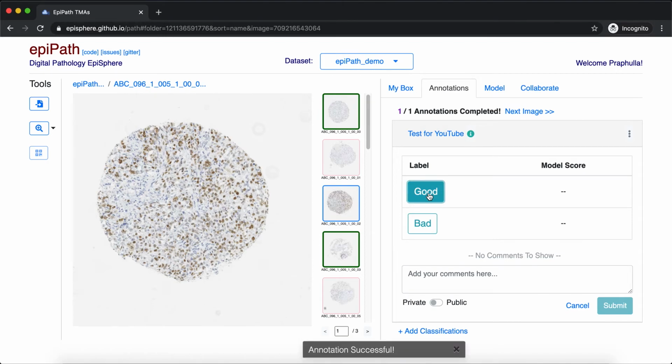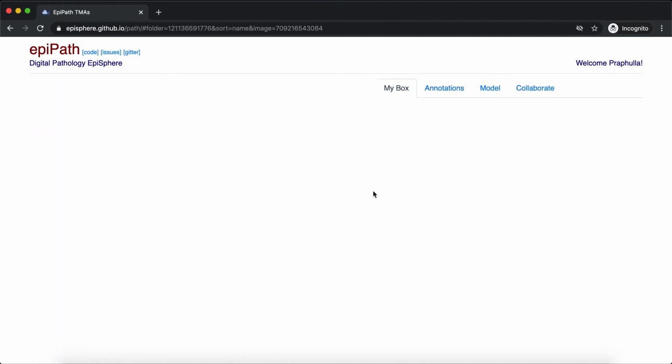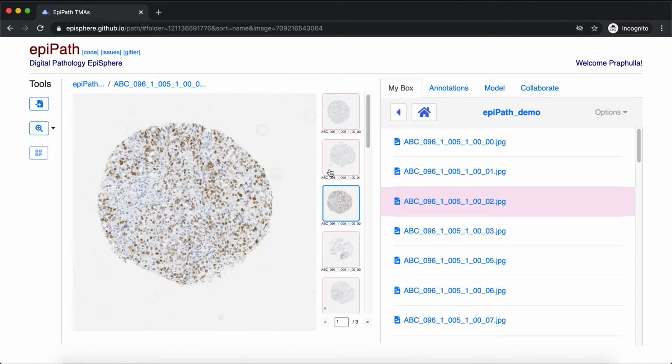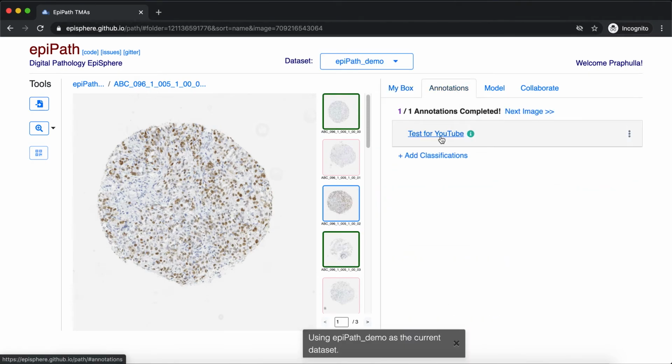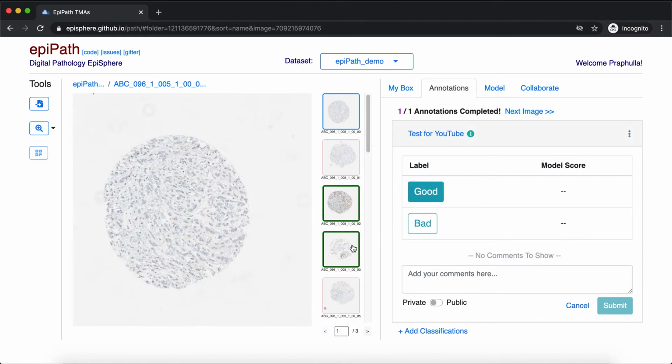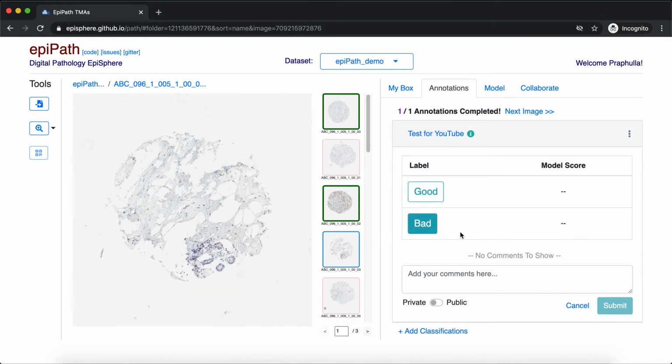Box then goes and stores it in what's called the file metadata. And whenever the application comes back, for instance, if I refresh, even though I haven't stored them in my browser, the application can just ask Box for those annotations back. So this image was good, this image was good as well, this image was bad. So that's how the application has memory despite not storing anything locally.